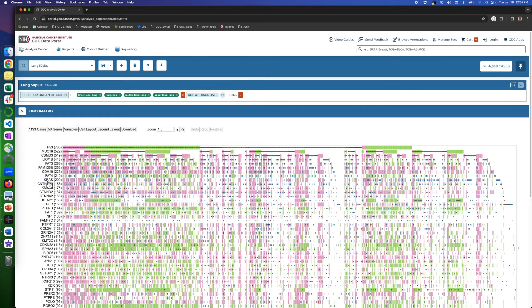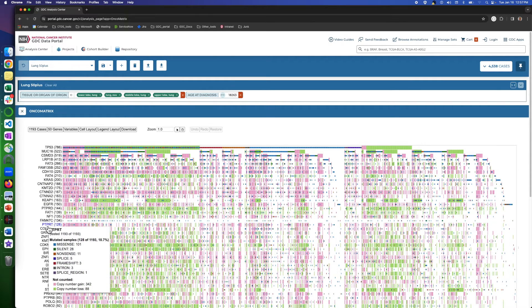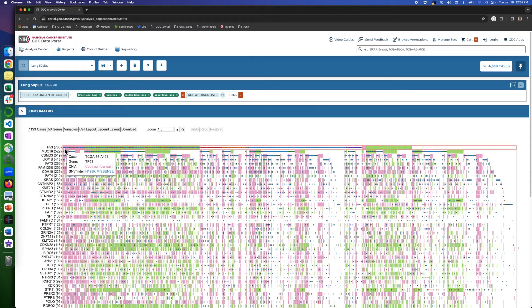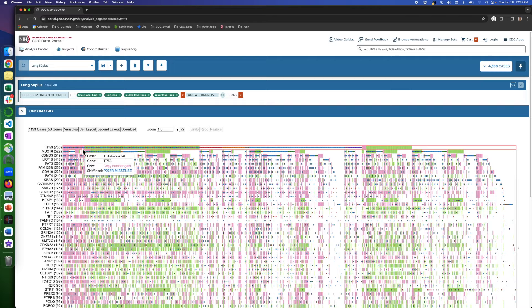Each row will stand for one gene, which are the ones that display mutations in the selected cohort. And if we hover the mouse over the columns, we can see the details about the cases in which the gene is mutated. The tooltip will show the case ID, the mutated gene ID, and details about the mutation type.